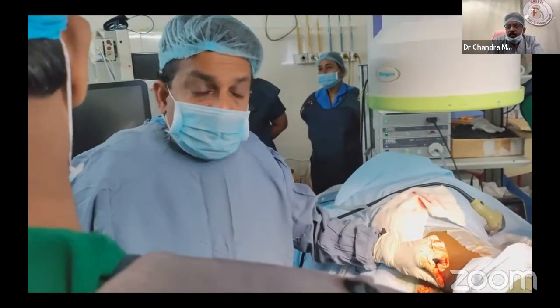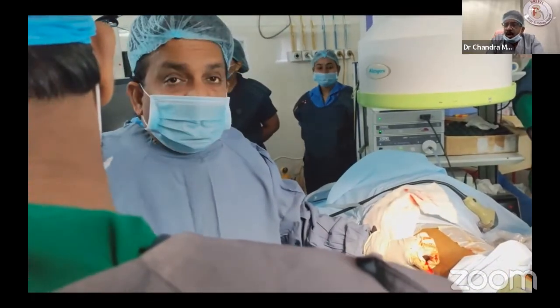Don't go. Stop. I use Alken. See, after doing 12 French, there are 2 options for this child. For maximum dilatation, it is better to keep up to 15 French. You have the 15 French steel outer sheath in companies like Storz and Wolf. This is the outer sheath, but they are not beveled, and their flexibility is less. Definitely these discussions have no conflicts of interest. It is my experience I am telling.